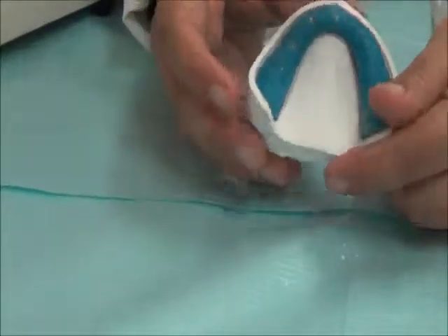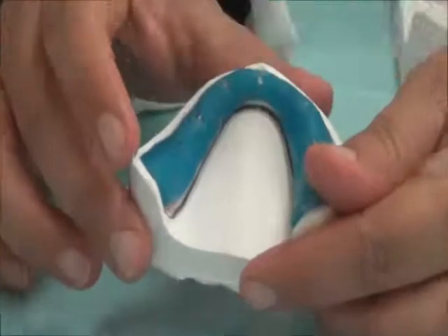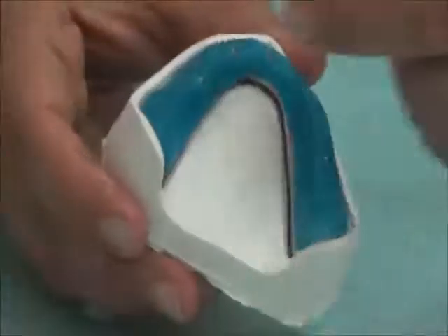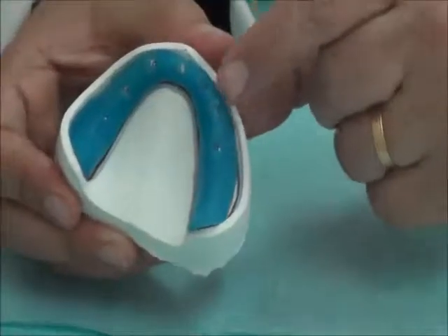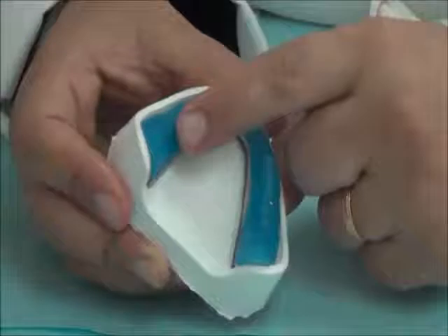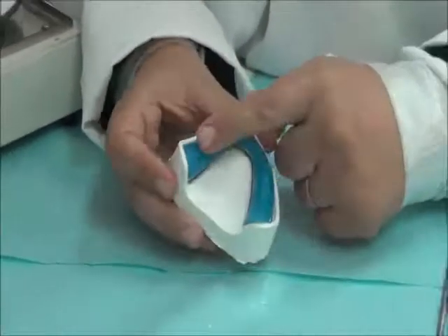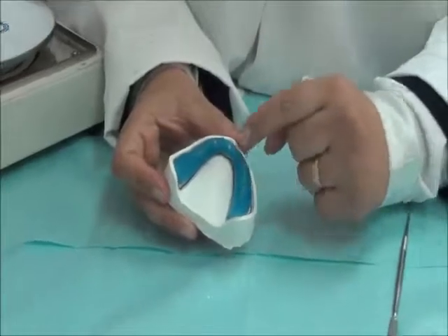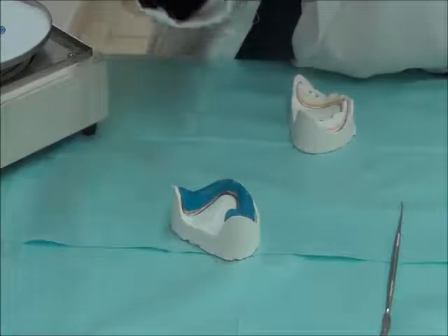It becomes easier. So if you had cured it and it becomes solid and you want to place perforations, you simply come in with the burr and trim them. But it's easier for you to make these holes in the light cured material while it's soft and then cure it. And this leaves us with the tray body ready, and then we add in the handle with some excess of light cured material.